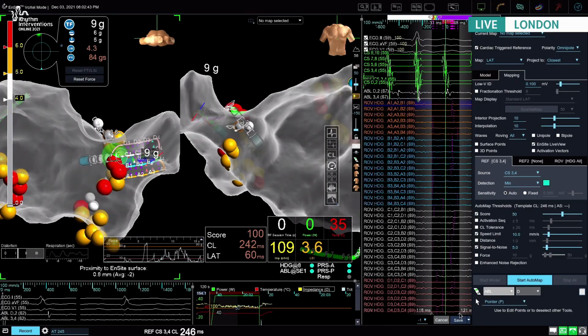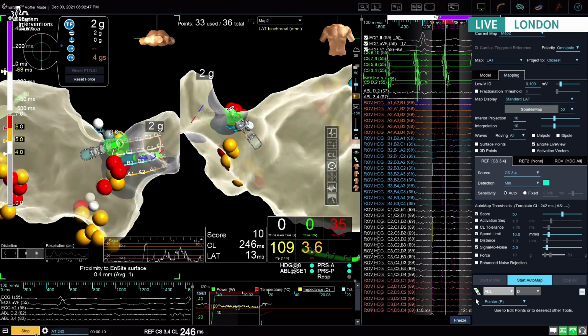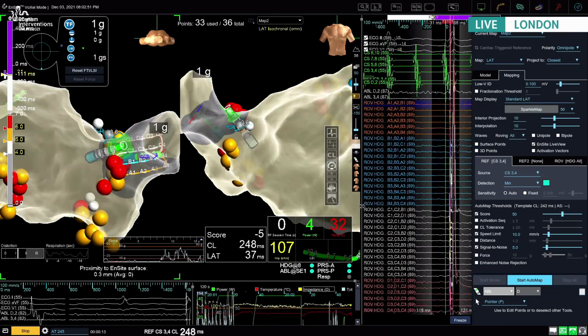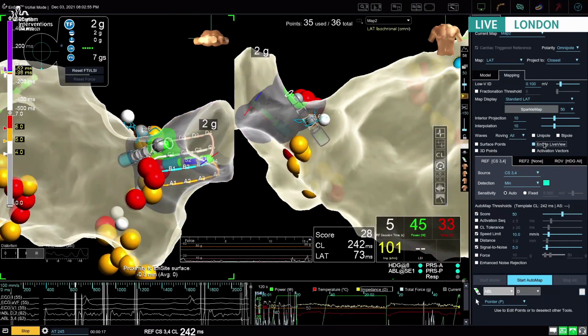Well, we may be selecting patients for cryoablation that have smaller atria, less scar, more paroxysmal, early persistent. So it may be more of a bias that we tend to use RF when we think the atrium's going to be big. So that certainly is a possibility. But the idea that it's iatrogenic isn't impossible. And the thing that I'm struck with in Ross's response is this is the approach that Bordeaux was using in the stepwise approach.